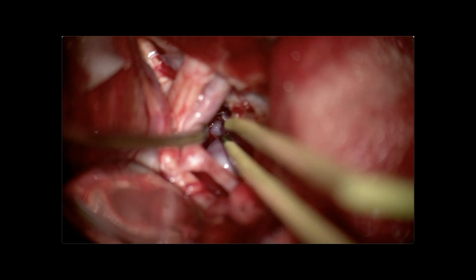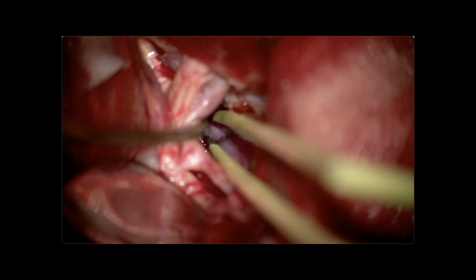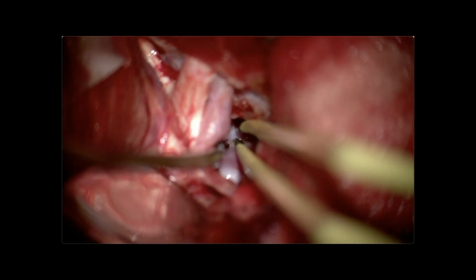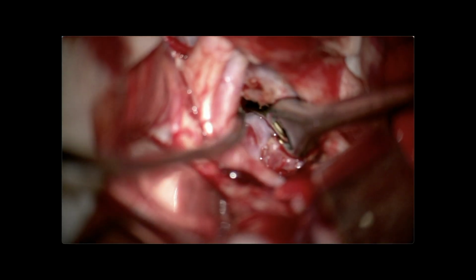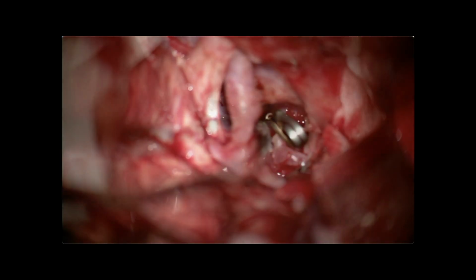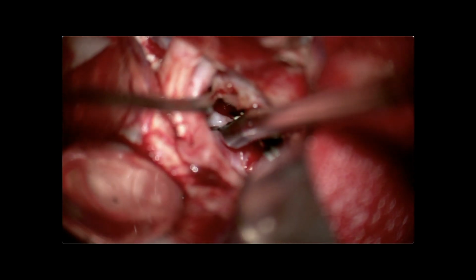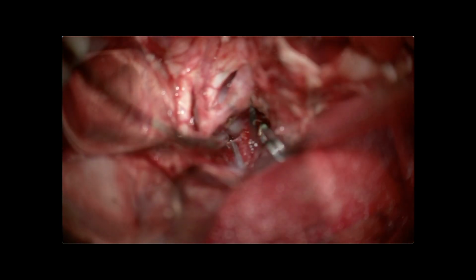The P1 segment is visualized from the opposite side of the posterior cerebral artery. A clip is planned to be applied. The neck area is examined. A temporary clip is applied to the trunk of the basilar artery. A temporary clip is applied to the P1 segment of the posterior cerebral artery from the opposite side.